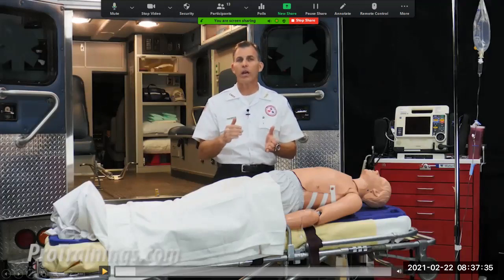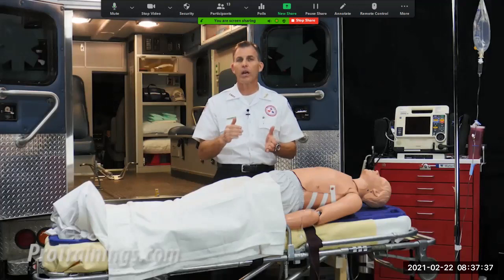Right, just before you continue. So in other words, now we've got a patient who's got bradycardia, who's not doing too well. We've tried atropine, we've tried everything, but we want to actually do pacing. All right, so we can do something called external cardiac pacing, and that's what this video is going to describe.